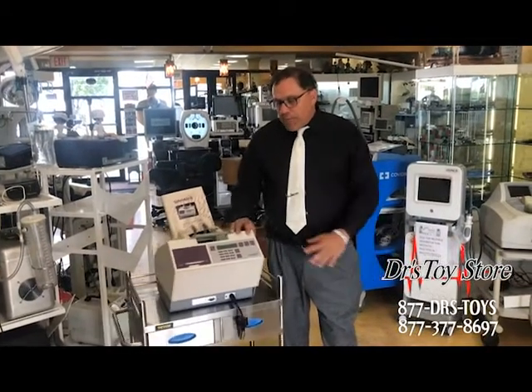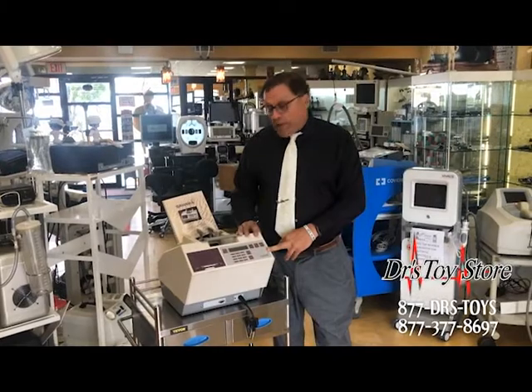We got one that just came in a box. It's never been used — at the Doctor's Toy Store, we buy some and repair them.